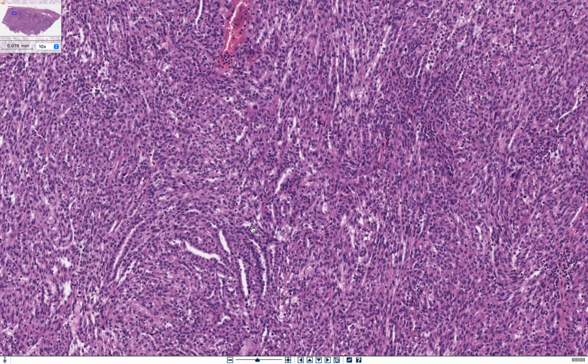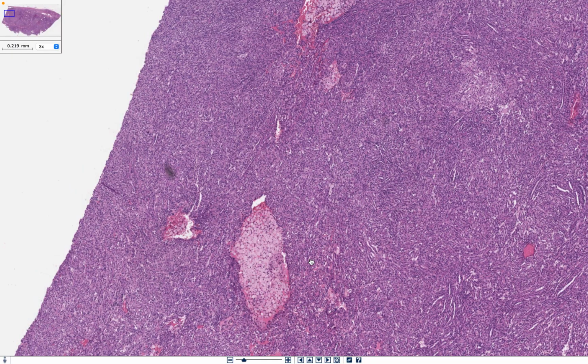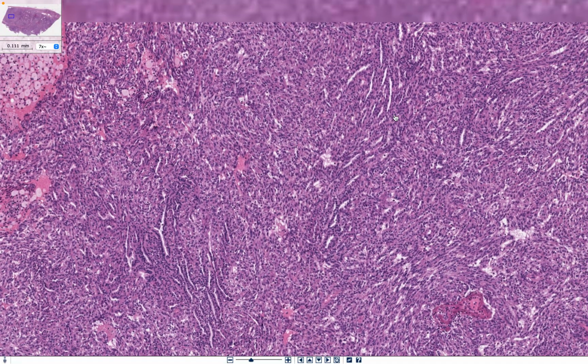Maybe this example is different, but this is a tubular formation. It's a little bit of a busy tumor, to be honest. A busy slide of tumor cells. Usually there is a myxoid area in between the cells, and here are the tubules or tubular formation. This tubule is elongated. Maybe this is not the best example, but it can do the job.